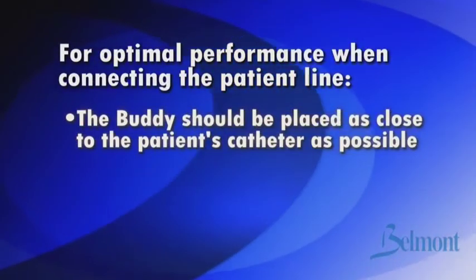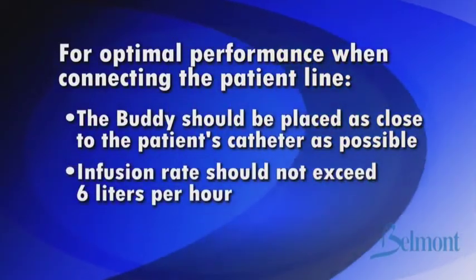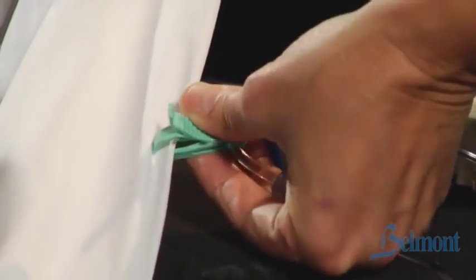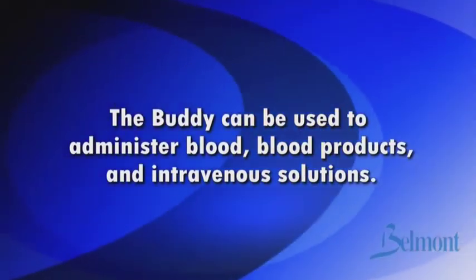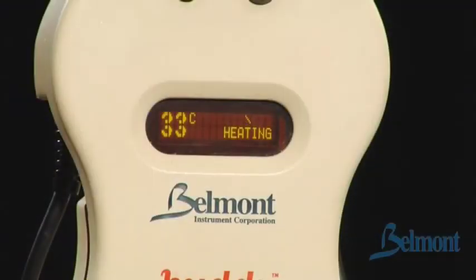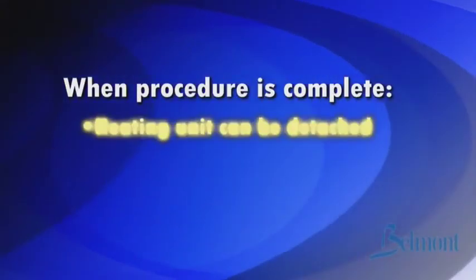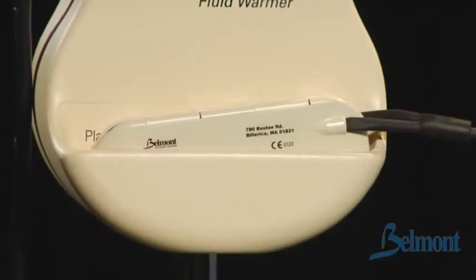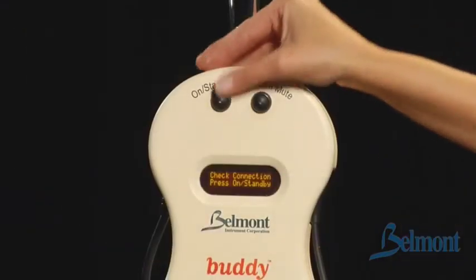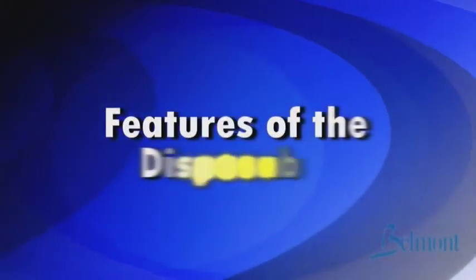For optimal performance, the Buddy should be placed as close to the patient's catheter as possible and infusion rate should not exceed 6 liters per hour. Secure the heating unit on top of the patient using the sheet clamps. The Buddy can be used to administer blood, blood products, and intravenous solutions. You will see the temperature displayed on the panel and the word 'heating.' The Buddy will vent air from crystalloid solutions during operation. When the procedure is complete, the heating unit can be detached from the power module and travel with the patient if desired. The heating unit can be stored in the pocket on the front of the power module. Hold the power button for one second to place the unit into standby.